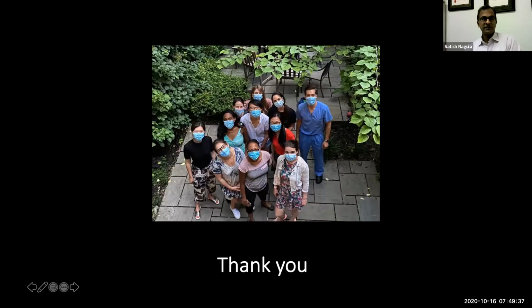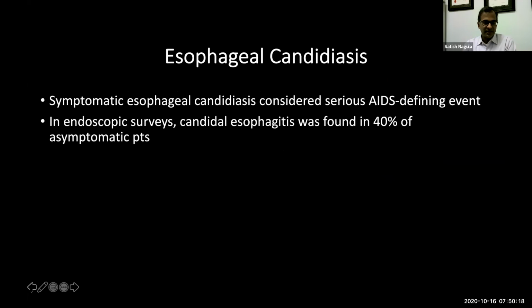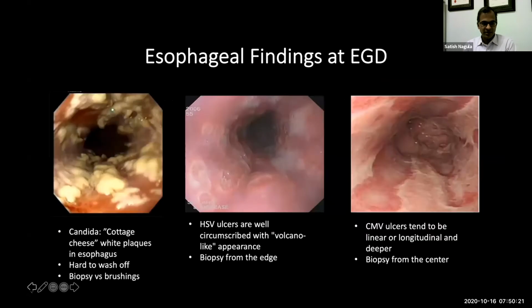Thanks, Steph. That was a really thorough and good overview of upper GI and HIV, and we don't see it as often. It's good to be reminded of it. There are a few people in the chat box talking about maybe that looked a little like esophagitis dissecans superficialis, which is a little bit what that peeling squamous mucosa looks like. But the problem is it doesn't help you with what they have, because it's a reactive, hi, I'm sick kind of process. But we already know that. It's hard in the video, it gets a little choppy on Zoom, but I didn't know if some of the solid lesions almost looked like squamous papillomas, but maybe that was just bunched up mucosa.